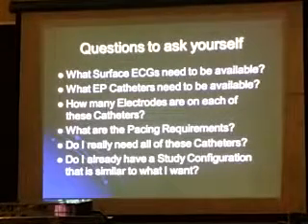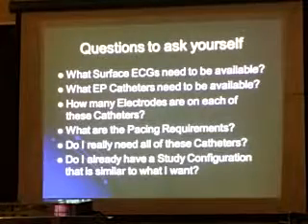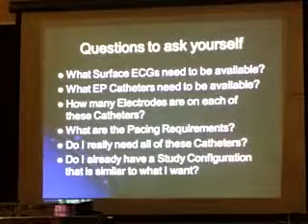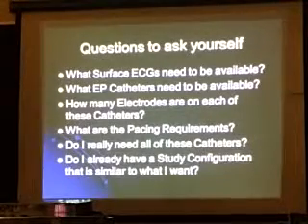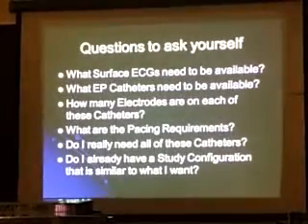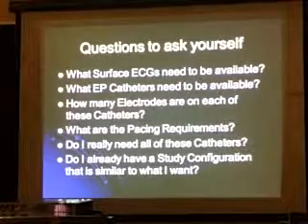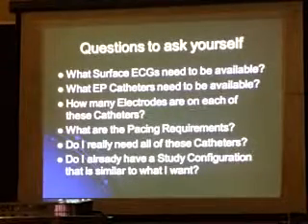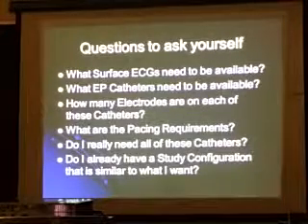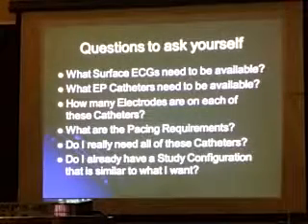Next question, do I really need all these catheters? Do I need to put everything that's going to do my regular EP study, my atrial flutter with its duodeca, then I got my lassos, and then we're going to try and do a basket catheter, all on one thing with it open? Because every time you create a catheter channel, you open up a way for noise to get into the system. Because once I say, look for here, it opens it up into the electrical system.